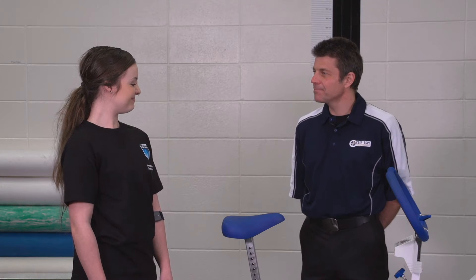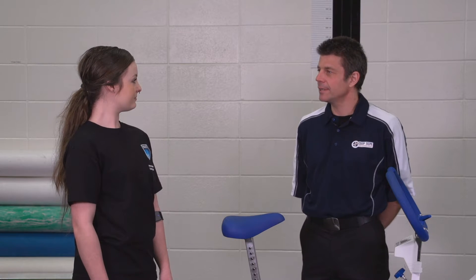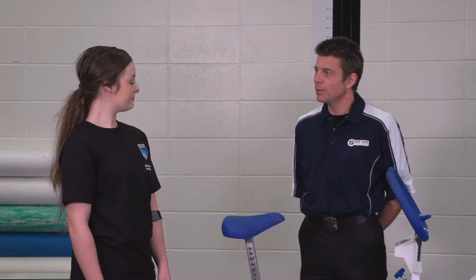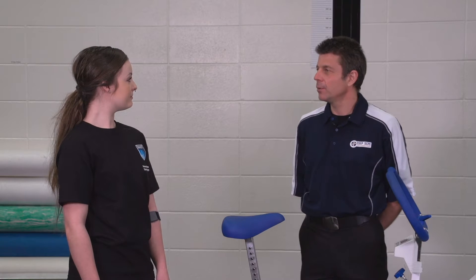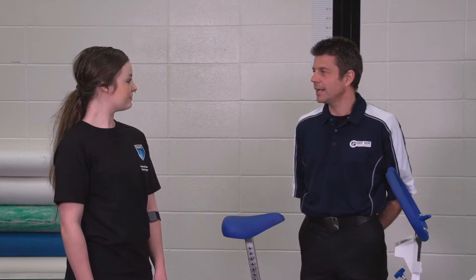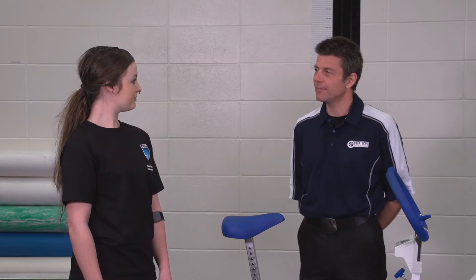Good morning Alara, thanks for coming in. Today we're going to measure your aerobic capacity, or your VO2 max, using the cycle ergometer protocol. What the test is going to involve is you riding at different intensities. We'll start with a nice easy intensity and depending on how your heart rate responds, it will determine the subsequent intensities after that. We're going to be monitoring your heart rate throughout the stages, and our goal is to get your heart rate between 110 and 85 percent of its maximum.